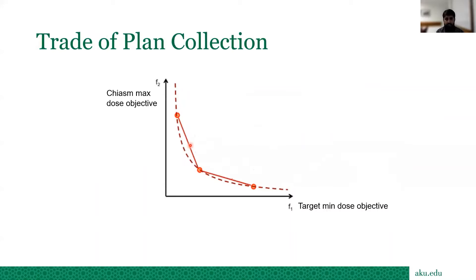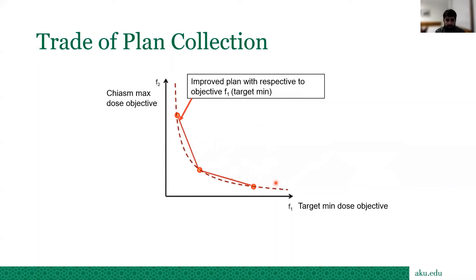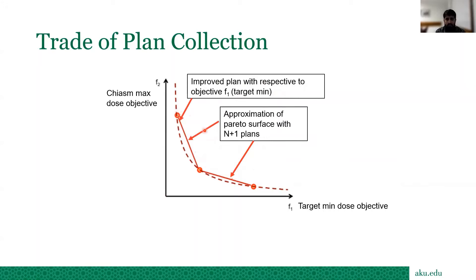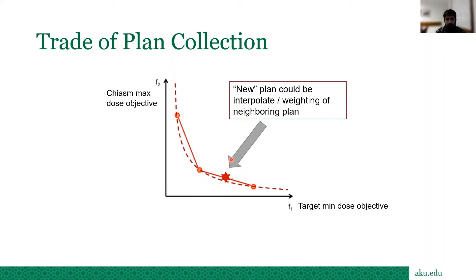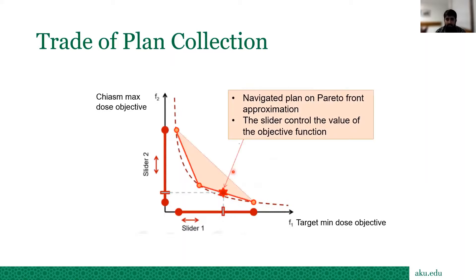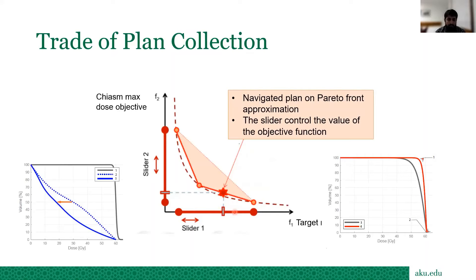Taking the example of the optic chiasm: the system tries to navigate and improve the plan with respect to F1 target minimum, approximating along the Pareto surface. This is the balanced plan, and this is the improved plan if optic chiasm improvement is prioritized. The solution can be found in between — a new plan interpolated by weighting of neighbor plans. There is a slider bar you move left and right to explore these solutions.